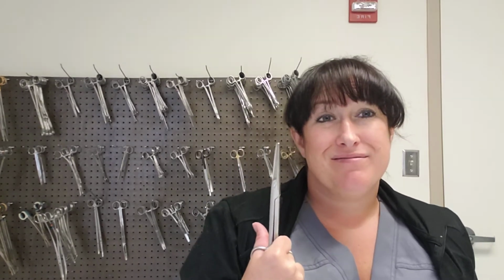So suture, such as what they're named after. Suture is that string that they use to approximate or close the wound together. There's got to be something that you use to hold it. So that's what suture is. You would cut suture with it. You can use this to cut mesh that they might need to leave inside the body. You can use it to cut drains because it's kind of a thick plastic.